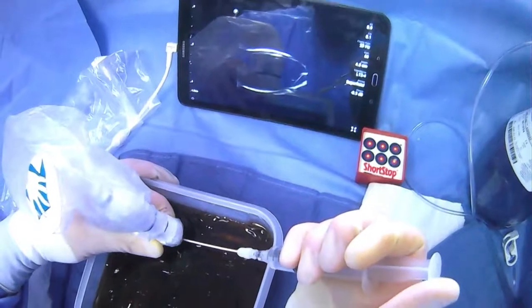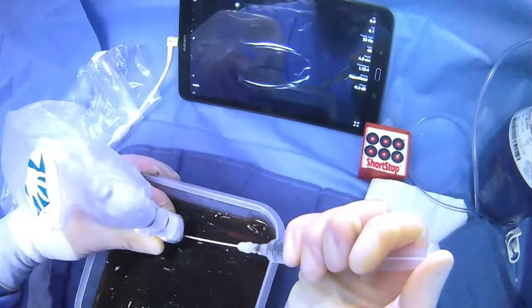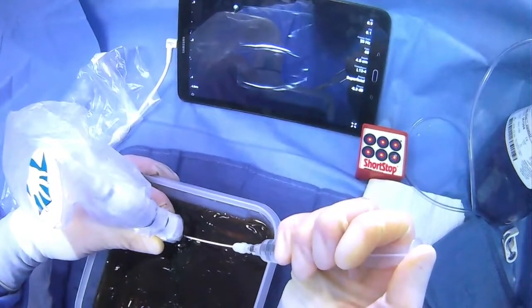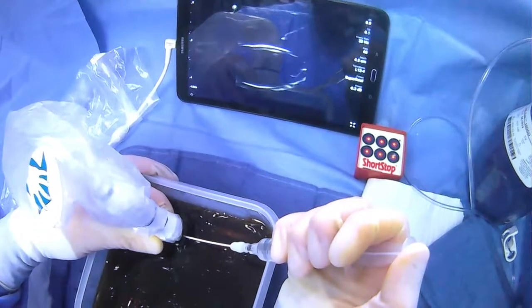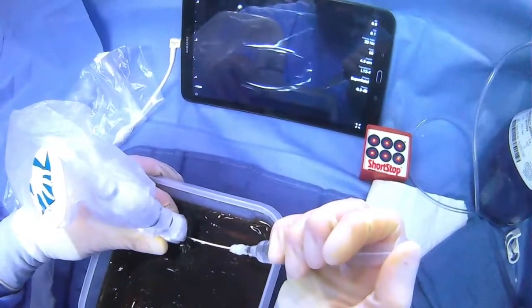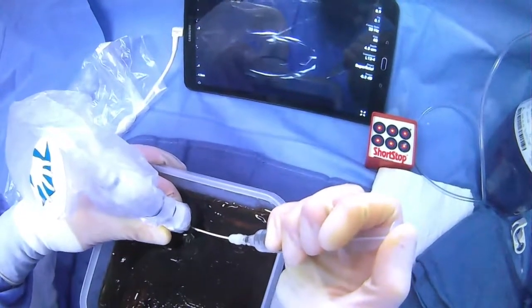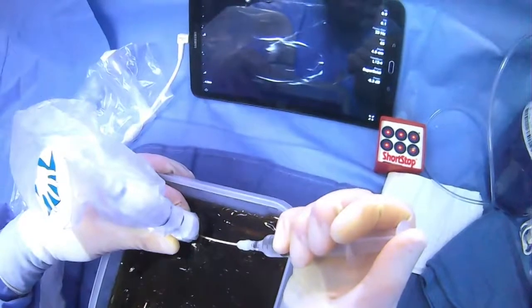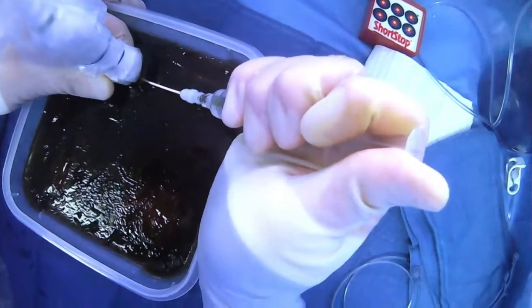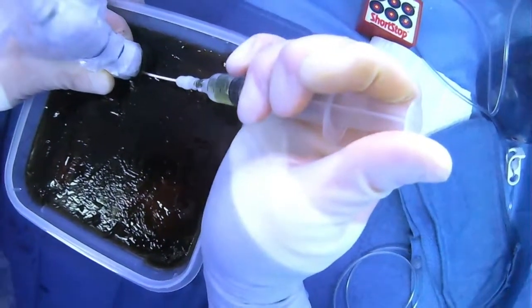We have our needle tip right there, we see it very clearly. We're going to give lidocaine, keep giving, going deeper and deeper, and now we're right on the edge. We're going to give a generous amount of lidocaine here, then just poke through — and we see our needle tip is right in the ascites. We aspirate, and we see we have a little bit of yellow ascites that came back.